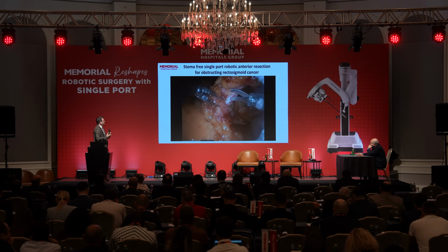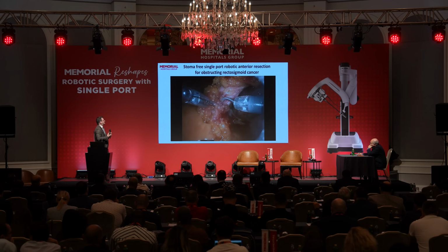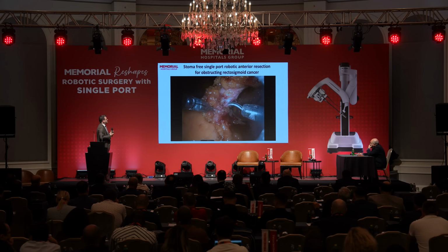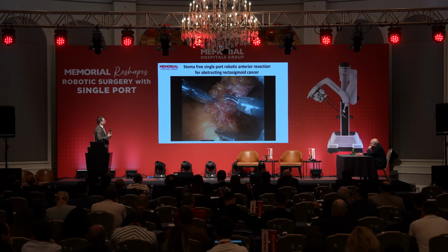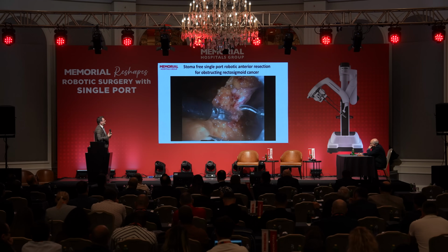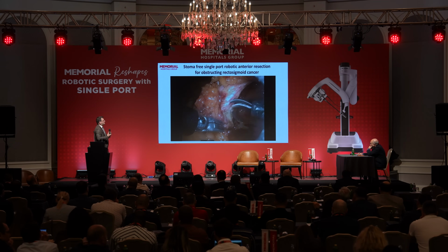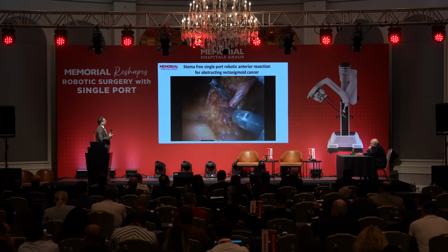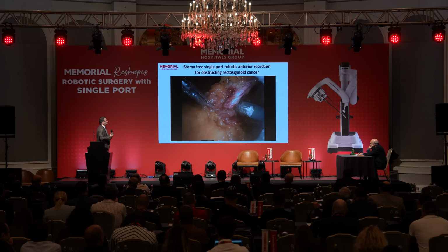I am trying to dissect the inferior mesenteric artery. We always use clips. We don't like vessel sealing devices because in my practice, they make me lose my way to find the proper dissection plane. You can go slowly to create an adequate place to apply clips. We use Hem-o-lok clips. So far, we haven't had any issues with Hem-o-loks. They are pretty safe.